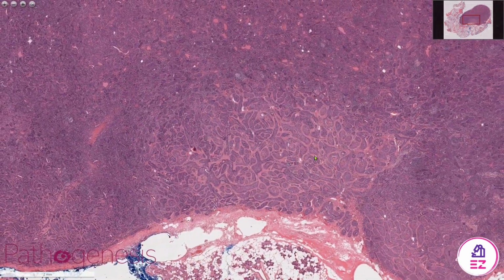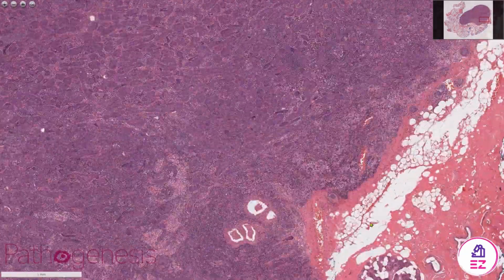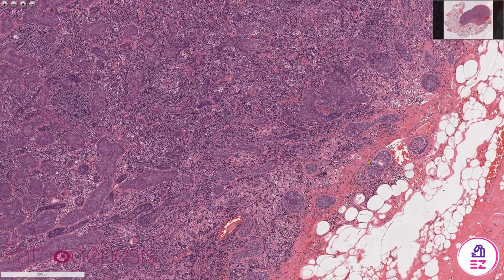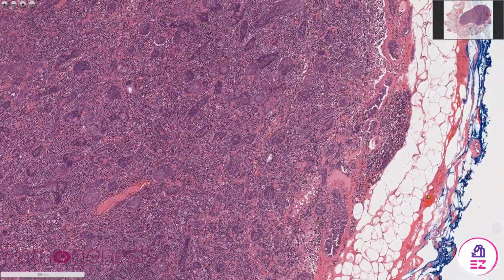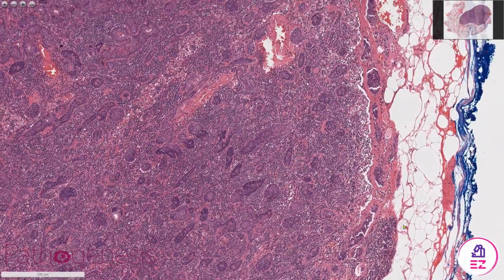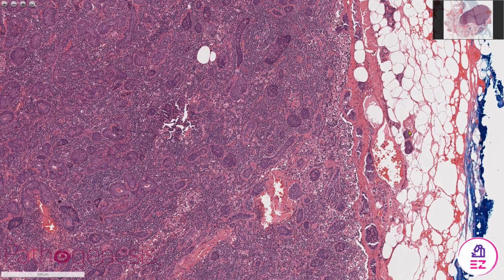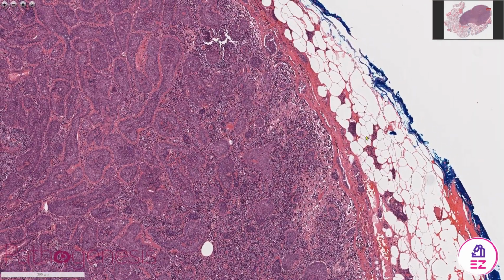So why is it a basal cell adenocarcinoma, not an adenoma? Well, what we need to do is just follow the edge of the tumour, and when we get to this point here, you can see that we've got nests of tumour starting to creep away from that circumscribed edge. As I follow it up, we've got this strip of adipose tissue. Again, the tumour's getting pretty close, and then if you look here, you've got nests of tumour actually in the adipose tissue. I think further up as well, there's a few little nests as well.